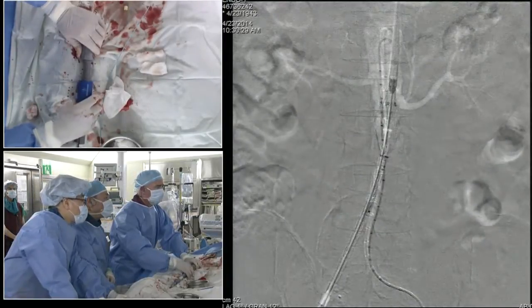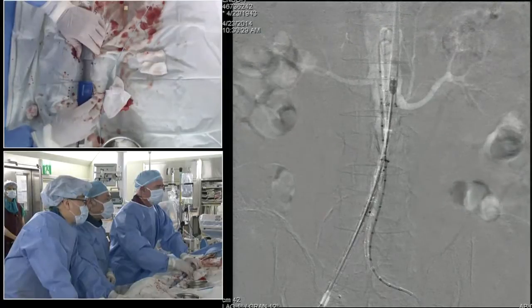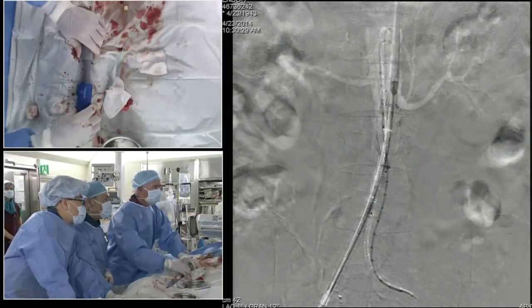John, are you like me? I really prefer the suprarenal fixation, don't you? Yeah, for almost all cases, Rich.